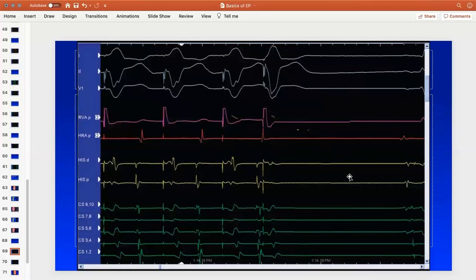Okay, we have ECG, followed by intracardiac tracing. We do stimulus pacing from the RV. There is pacing with the RV activity, so we're capturing the V with every beat. Right. Okay. Yes. So now the question: are we conducting to the A?